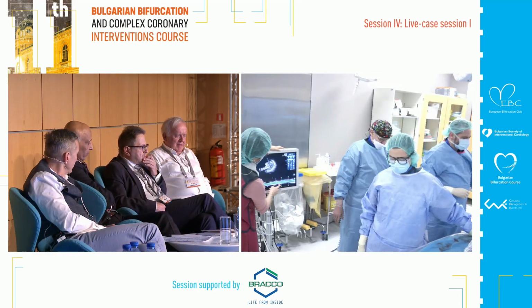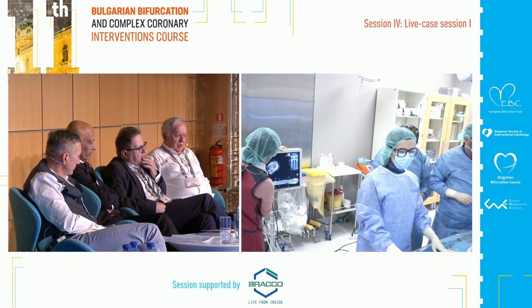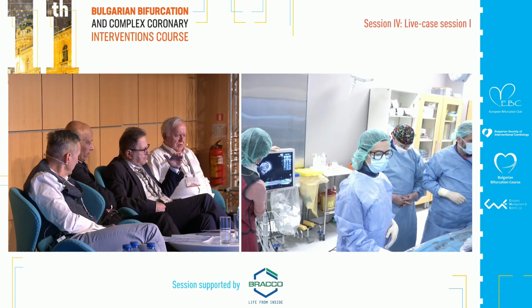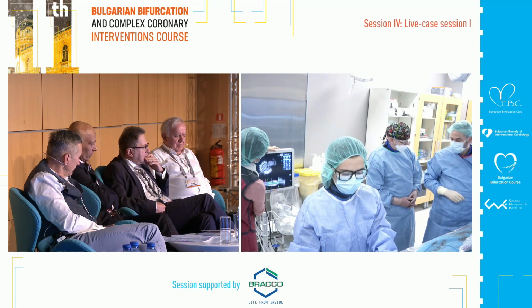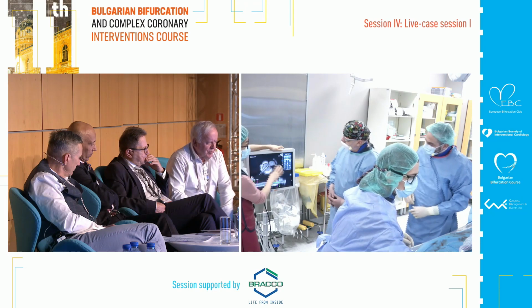I would suggest you check the bifurcation of circumflex and left main, because I saw a kind of calcific plaque in the orifice of circumflex. Let's predilate, and you have to plan the technique so as not to lose the osteal circumflex. No, osteal circumflex is clean. This is osteal circumflex, no calcium at all.